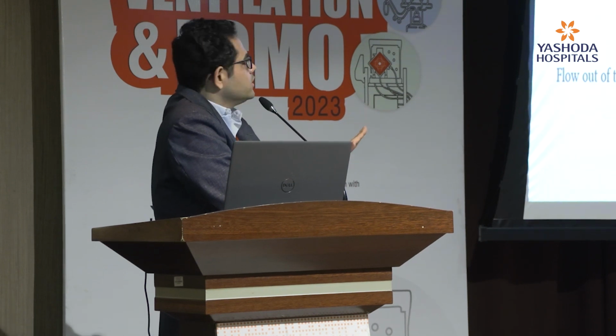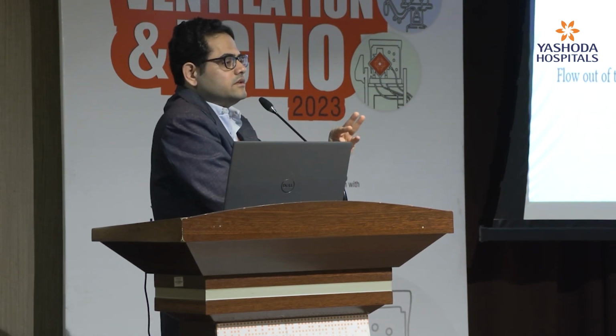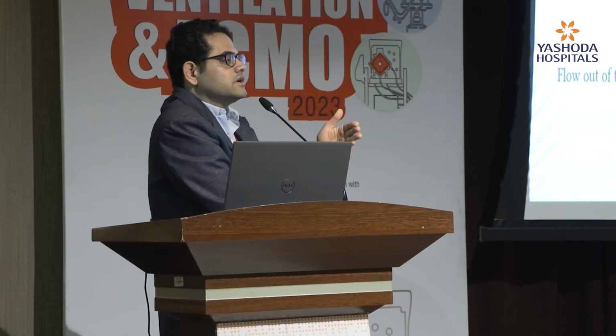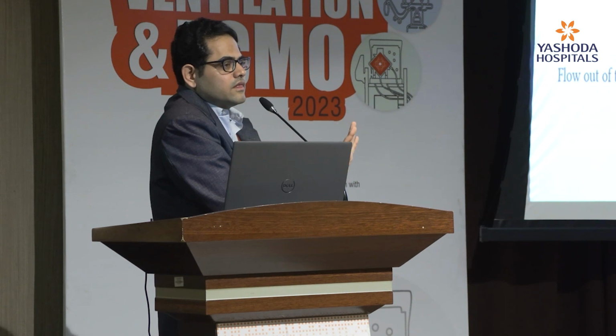The advantage is of what? The work done by the patient is minimum. So overall the work will be reduced. So nowadays everybody with a ventilator will prefer flow trigger.